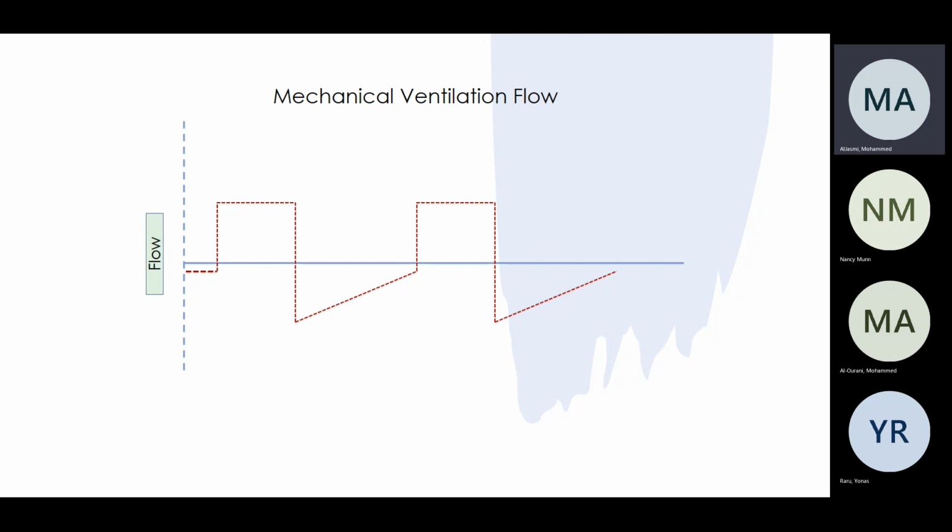Is that right? Yeah. But this patient is not a normal person. Maybe he needs more expiratory time. Like in who? Like in a COPD patient, asthma patient. That's right. So I need less, so is this for sure auto PEEP or not? It's very harmful. Let's do something right now. You just looked at the flow.